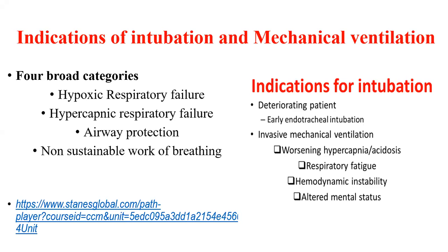As you saw, there are indications for intubation and mechanical ventilation: if our patient is hypoxic and has respiratory failure, if the patient has acidosis, and if our patient needs airway protection, for people with low GCS.